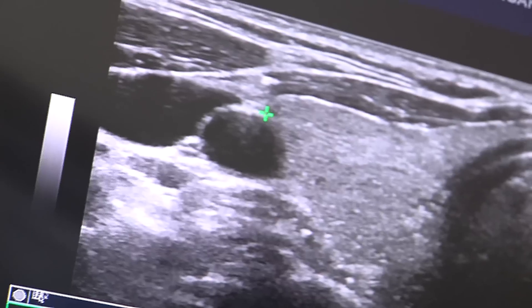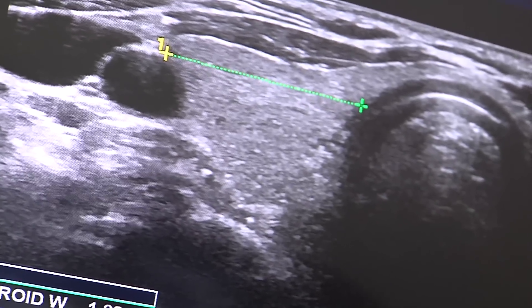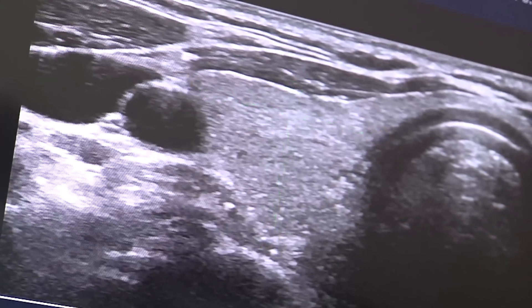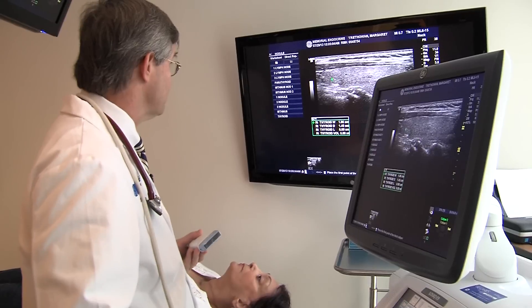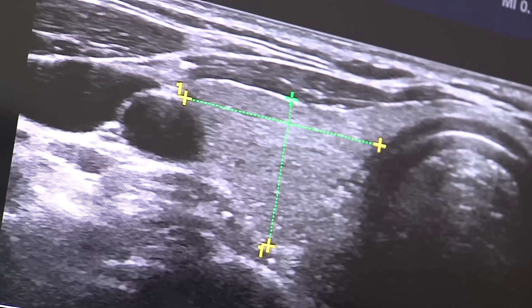We lay the probe on the right side of your neck and we just start to peek. This is the width of the thyroid — I measured all the way over to the windpipe. That's the width, and here is the depth of the right thyroid lobe. Now instead of putting the transducer across your neck, we're going up and down the neck, and this measures the length of your right thyroid. Your right thyroid gland looks very normal — the right side looks pretty good.